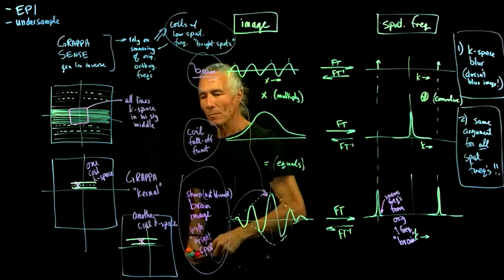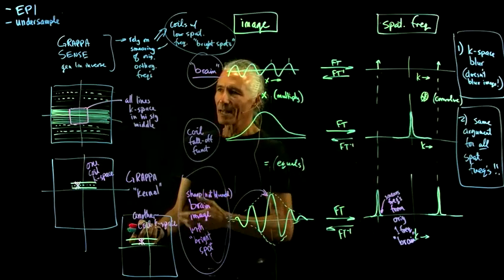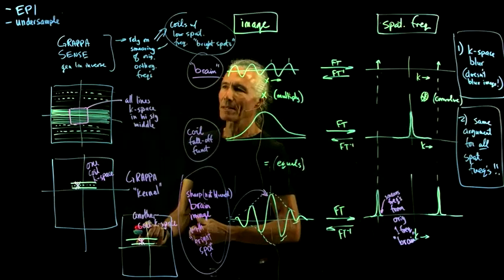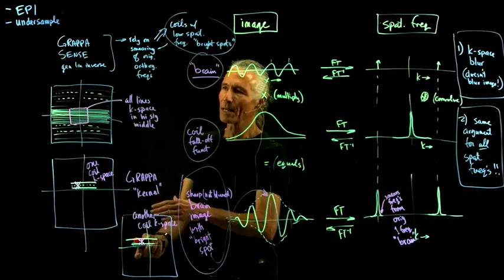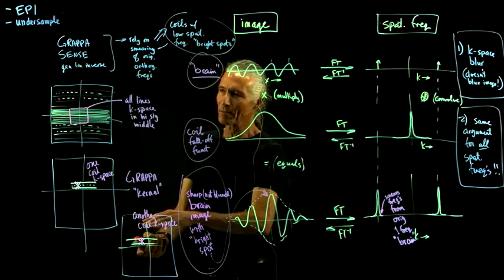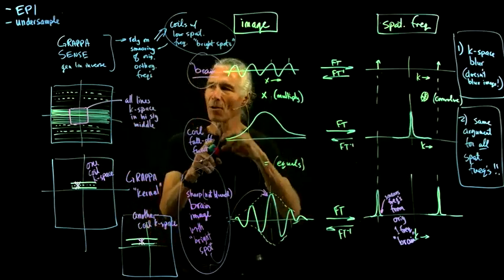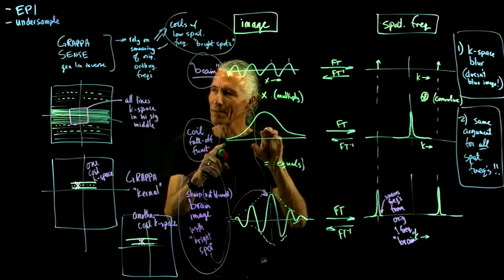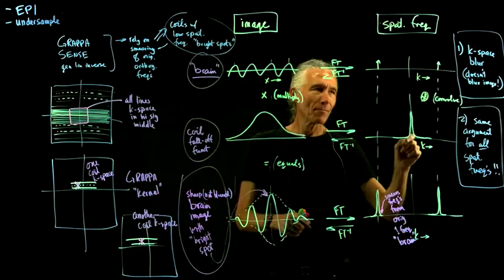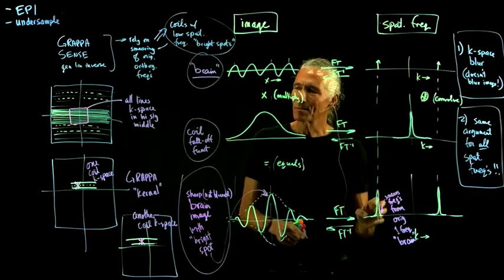So basically you can intelligently interpolate what the missing data should be on the basis of the surrounding lines, which normally would be completely orthogonal. The spatial frequencies would be completely orthogonal, but because of this very low spatial frequency coil fall-off function, which Fourier transforms to a teeny little Gaussian, which we then convolve with each frequency, it smears out the data.